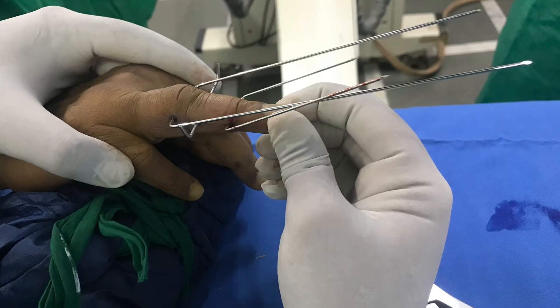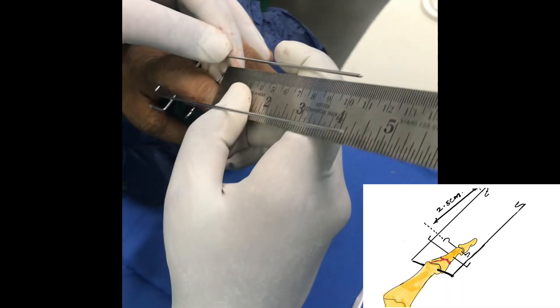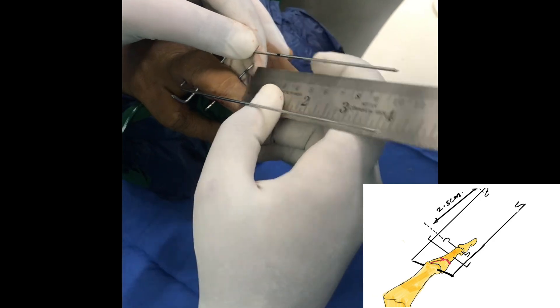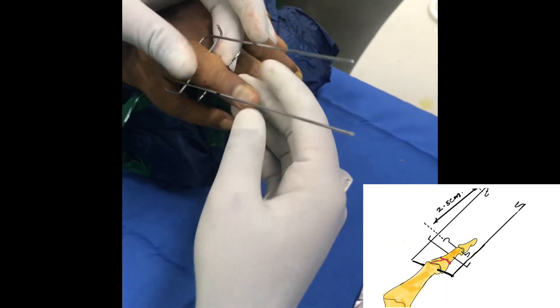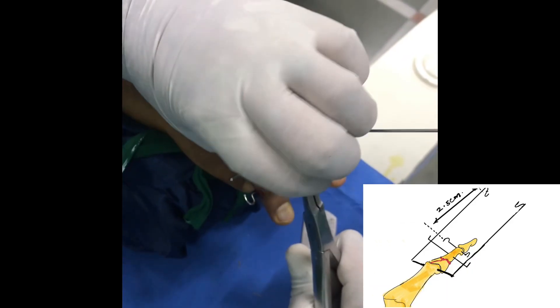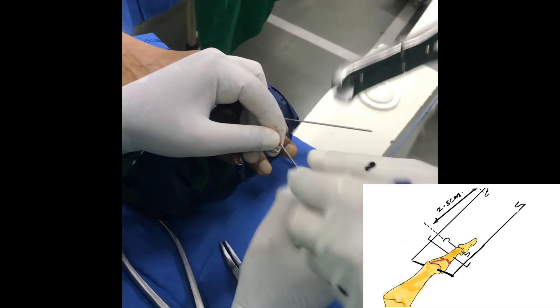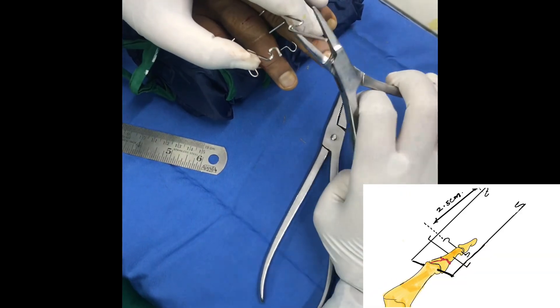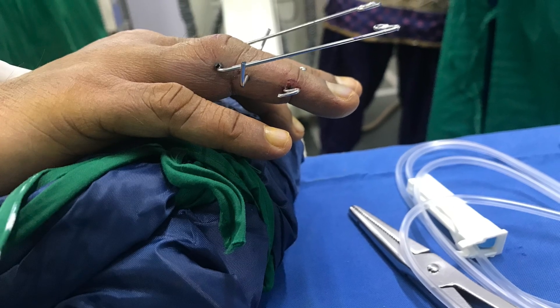After passing this wire, you have to bend it. Hooks are made in the proximal axial wire and the distal wire. After making proximal hooks, distal hooks in the axial wire are made at a distance of 2.5 centimeters from the proximal hooks. A marking is done and the distal hooks are made in this fashion. You require a very sturdy nose plier and a very good cutter for this. After making the distal hooks, measure to confirm the distance is 2.5 centimeters.